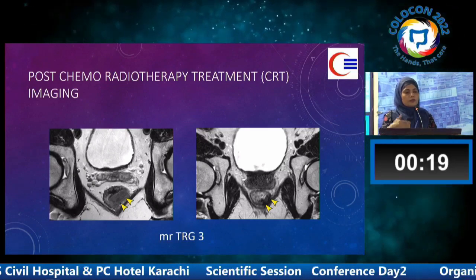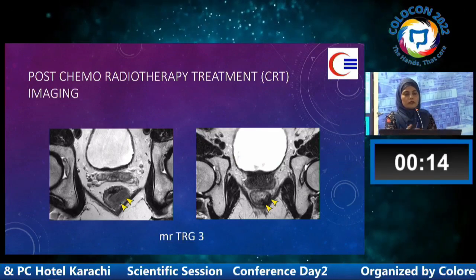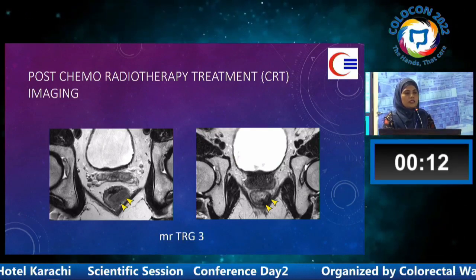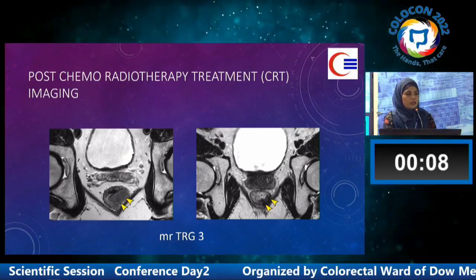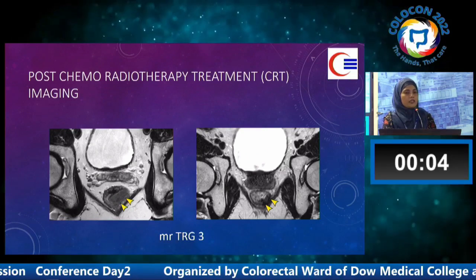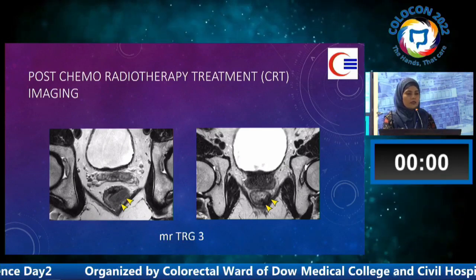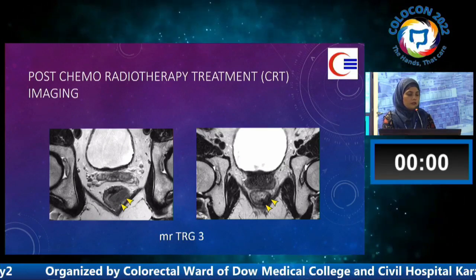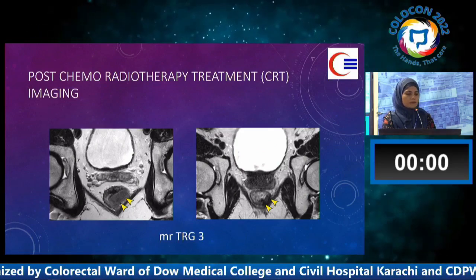This is all for today, because otherwise TRG is a totally different story in which we have to consider each and every dot of the tumor, each and every dot of the lymph node, and the EMVI, each and every aspect that was reported in the pre-treatment imaging must be reported again in the post-treatment reporting to compare whether the response is good or not.